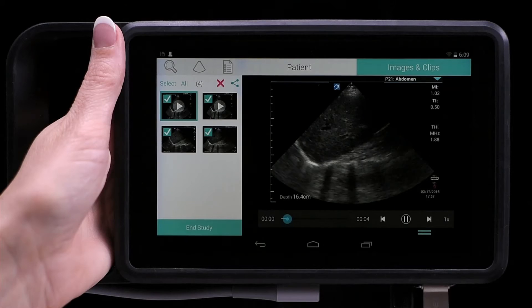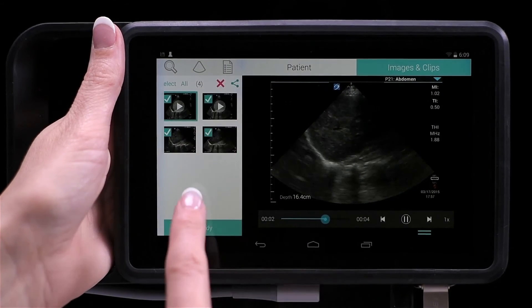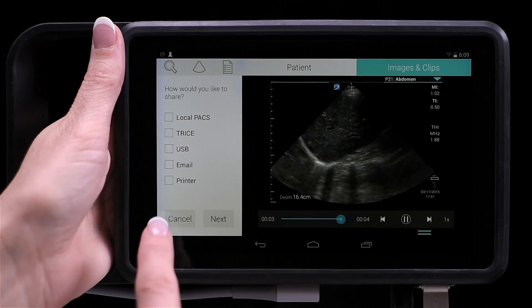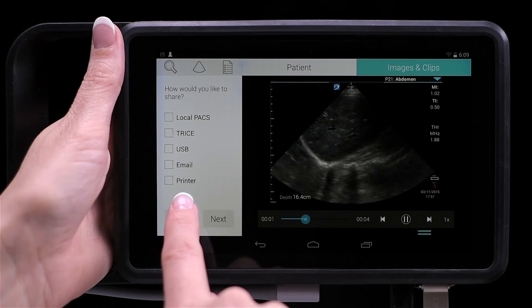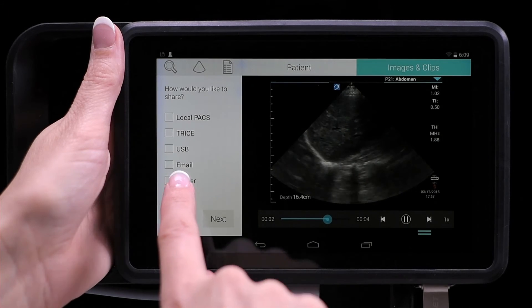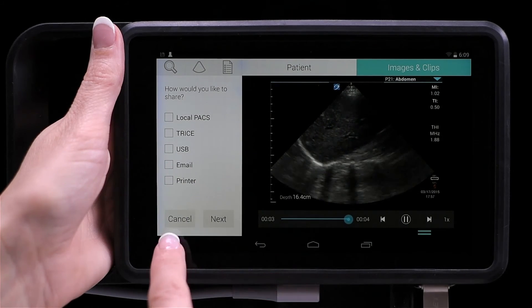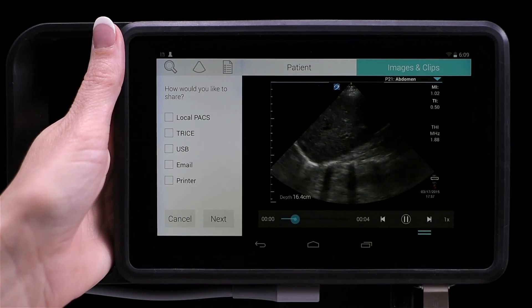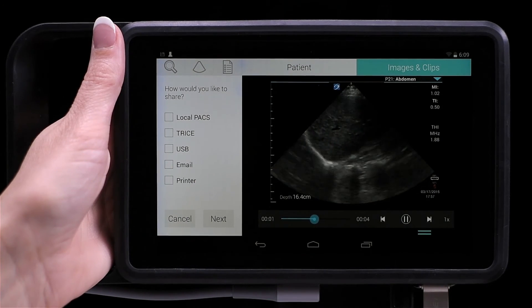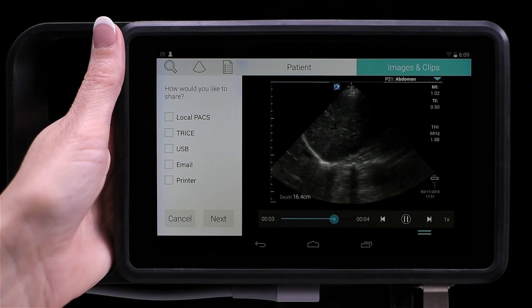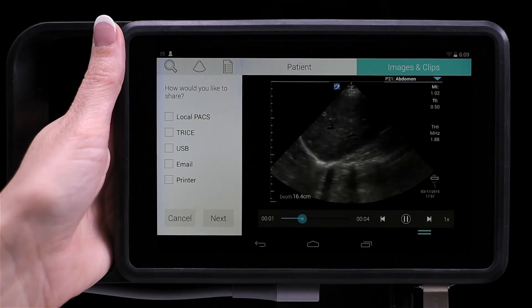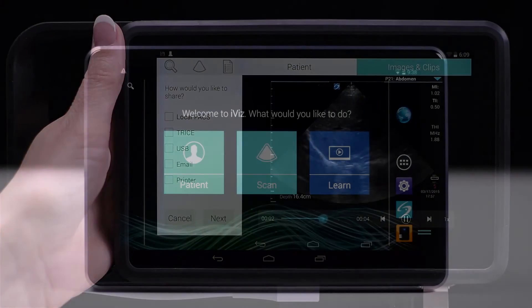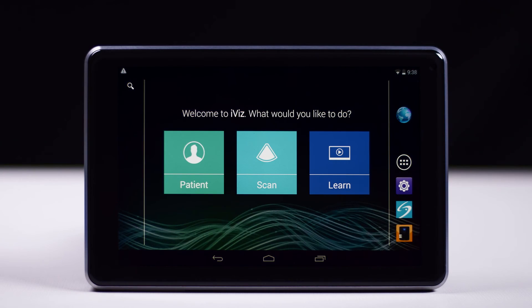You can also share images and clips to email, printers, DICOM, and Trice, which is a cloud-based image archive. For more information about managing images and clips, refer to the iViz user guide.